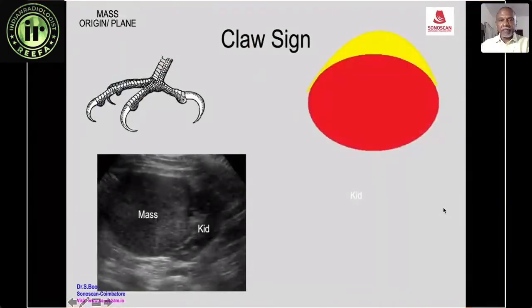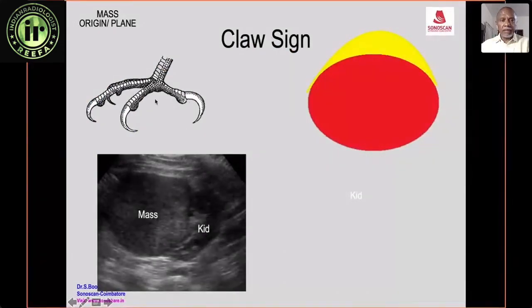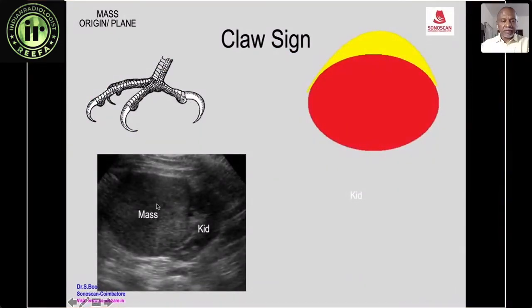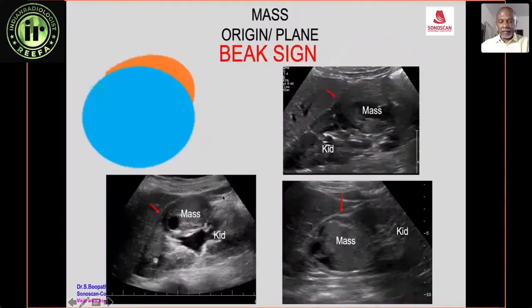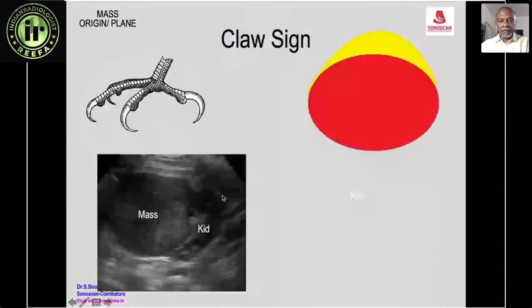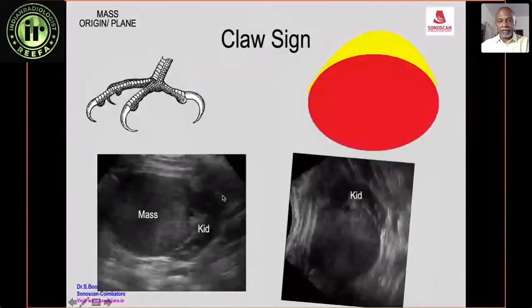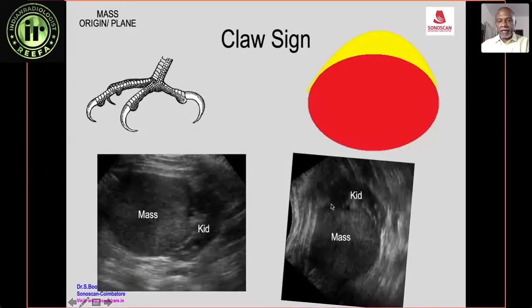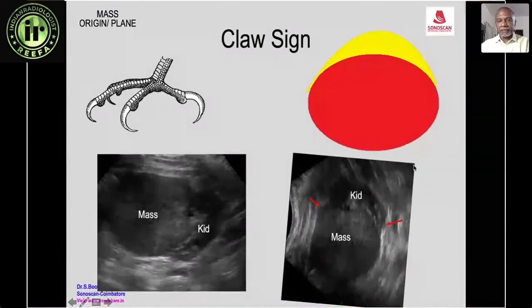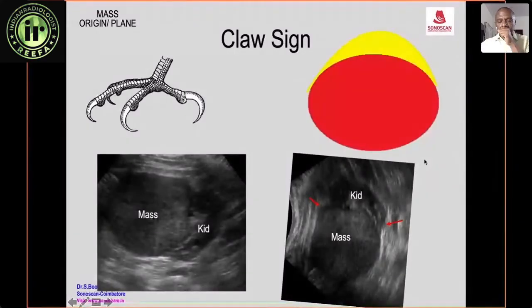The claw sign is essentially multiple beak signs. Here the kidney and mass are seen; inverting the image reveals the kidney forming claw-like beaks on both sides of the mass — similar to a claw. This confirms that the mass is arising from the kidney.